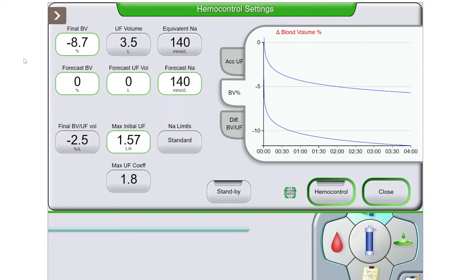And I do want you guys to remember this is just a simulation. I don't think it's a perfect representation of the real world. So certainly I can take the time to sit with you looking at real patients and making real-time adjustments, and it should help to consolidate this knowledge a lot better.